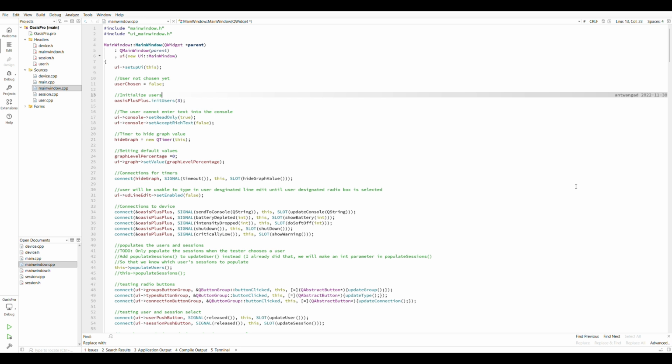If you're curious about the code, I recommend that you go check out the GitHub repo. It'll have all the files, and you can even test it if you'd like by downloading Qt Creator and opening the Oasis Pro file as a project. You can configure it with the default settings it provides, and you should be able to click in the bottom left here, this play button, and test everything you saw in the video, or go a little deeper if you want.